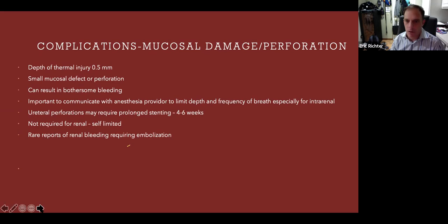One way to limit mucosal injury is to have good communication with your anesthesia provider so they can limit the depth and frequency of breaths, especially when you're lasering in the kidney. That's not as important when you're in the ureter because the ureter is not moving around.